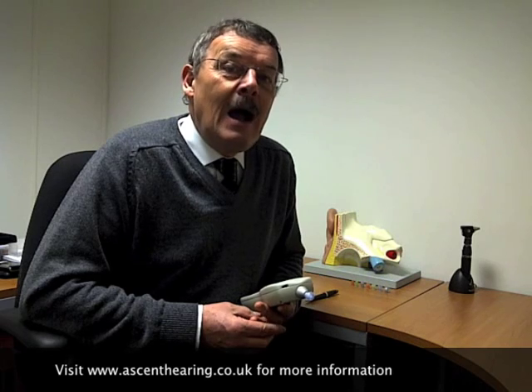So quite often your ear is stiffer. For example, if you've got the cavity behind your drum, the middle ear, full of fluid, the little bones have got to work in a fluid rather than an air-filled environment. So in the main, a lot of problems that we see in clinics cause higher stiffness.